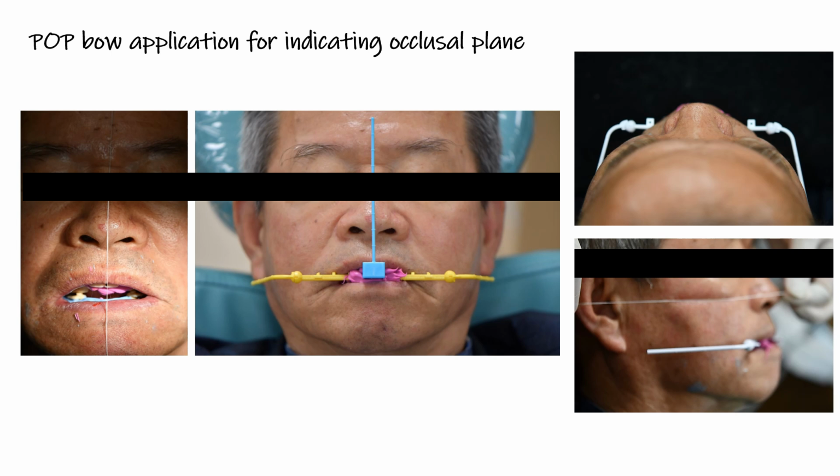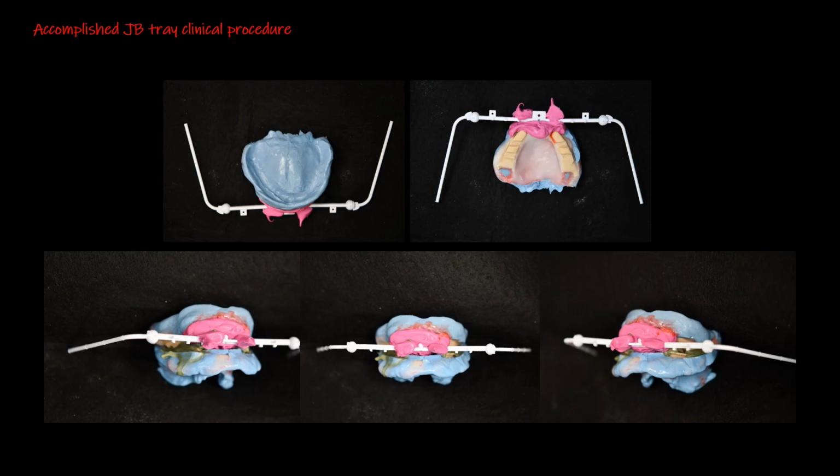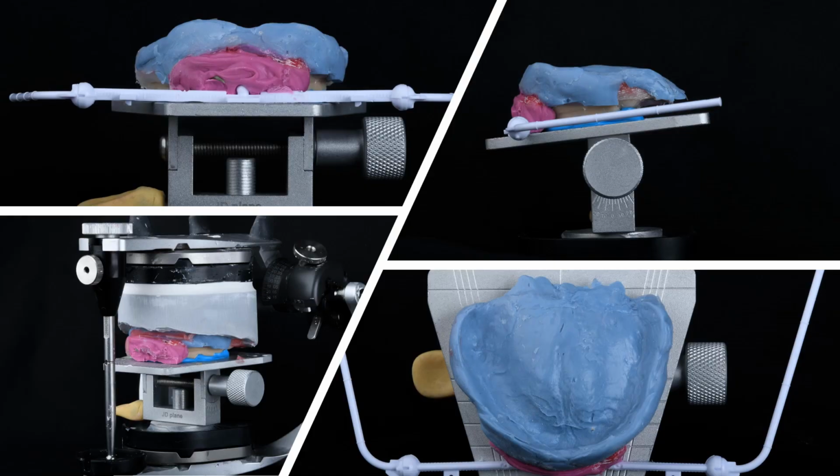Now at this point, attach the face bow system to the contact point where the lip closes, using silicone bite taking material. By doing so, you can transfer essential information to the lab, including the occlusal plane, midline, and upper lip positions. Additionally, it provides details about the left to right parallel relationship and the Camper's lines for occlusion.